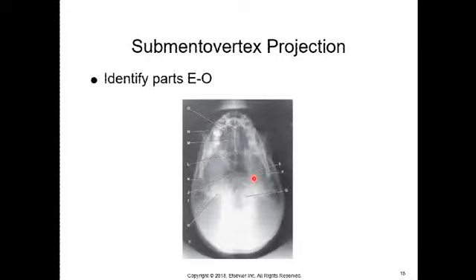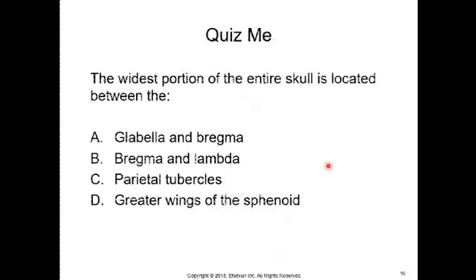And then, of course, there are other things I would want you to point out. Obviously, this is the foramen magnum here. H would be pointing to your petrous pyramids, which again is a big glob of white here. These are your sphenoid sinuses. Just so that you know the basics for cranial anatomy on a slide like this.